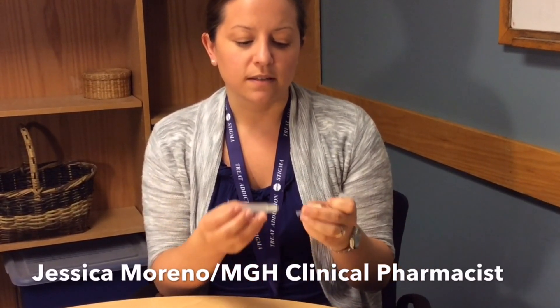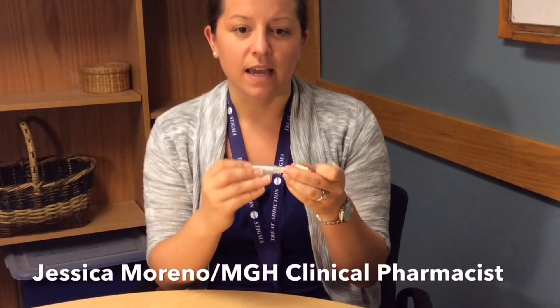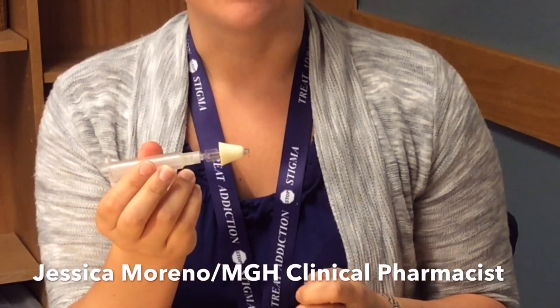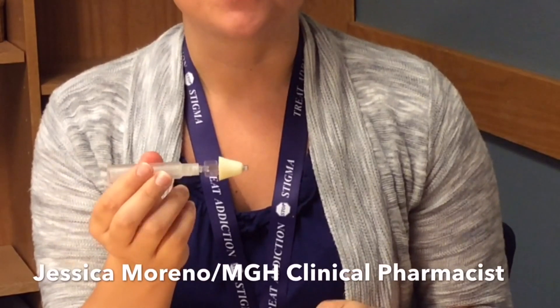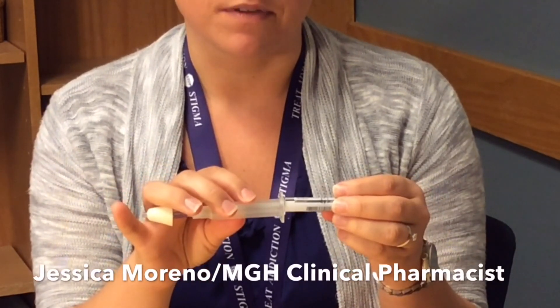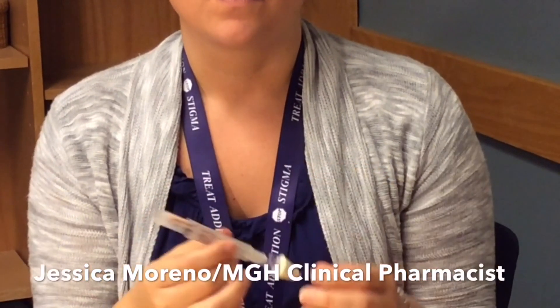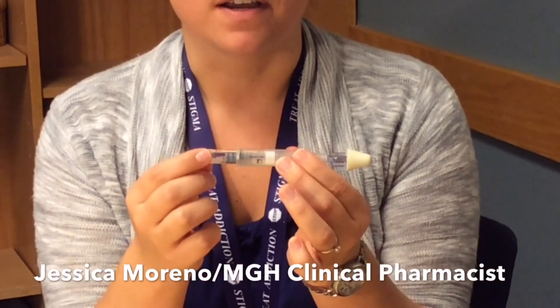What you first want to do is twist the nose piece onto the end of the plunger. Once the nose piece is secure, twist the vial onto the other end of the plunger. You'll be able to feel when you've twisted the vial down far enough.